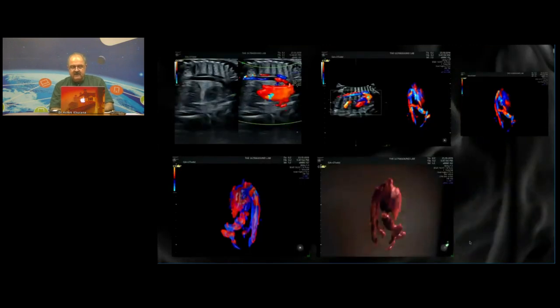Typically, we notice that there should have been, as I showed you earlier, a nice, beautiful vena cava sitting between the heart that you see here and the vessels behind. But here we see one vessel right close to the aorta. And when we see a vessel like that, I say, yes, I know that that should have been a vena cava there. There isn't a vessel. Therefore, I have a zygous system which has come up instead there. Therefore, I know that there's been an interruption of the vena cava. And I'm getting a very clear demonstration, both in terms of the lower images, one of which is color and one of which is in a monochrome. And notice that there's a little bit.